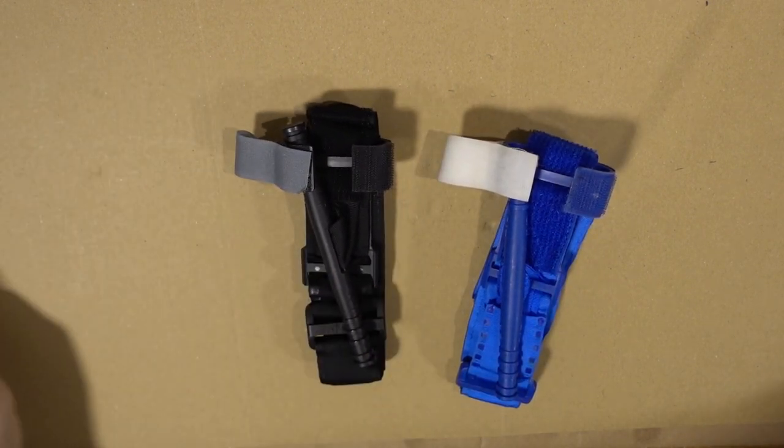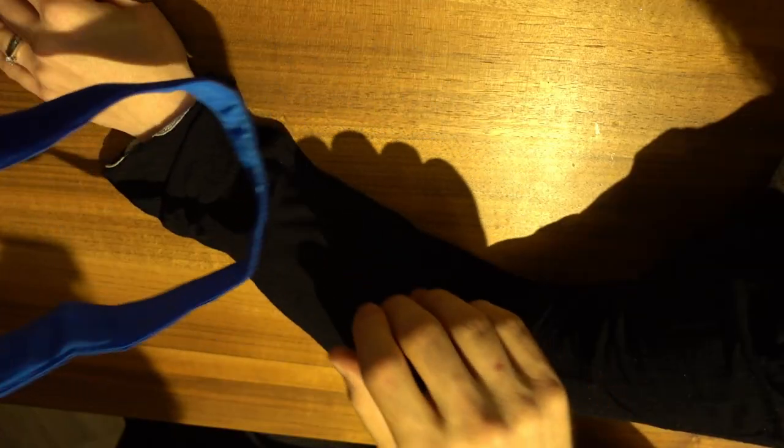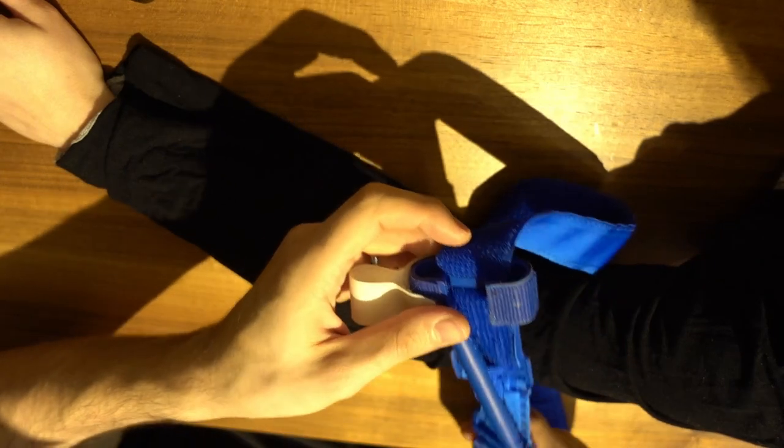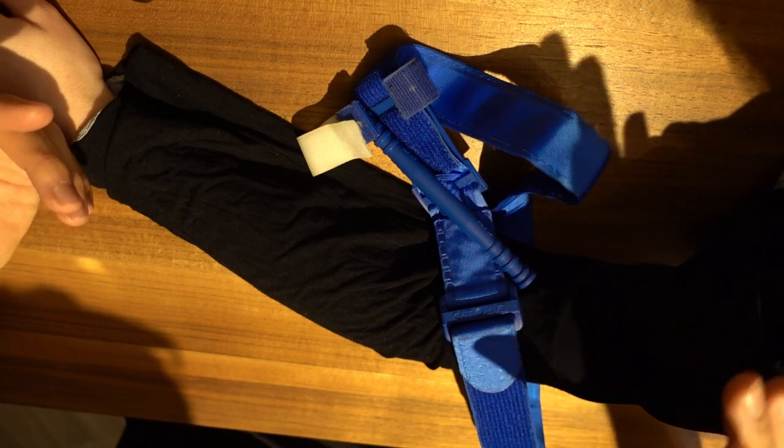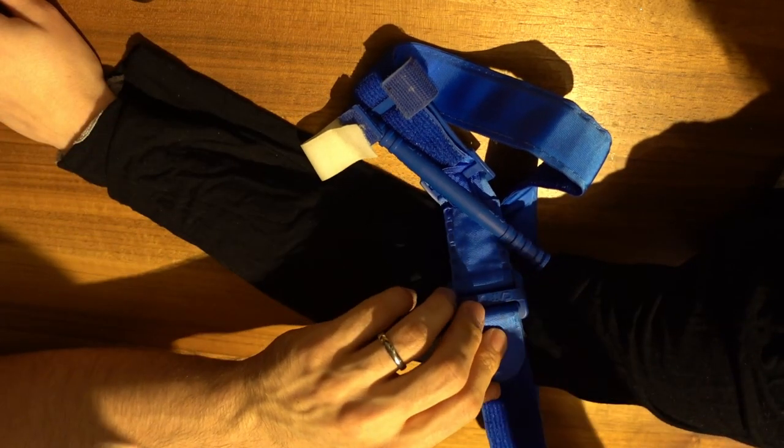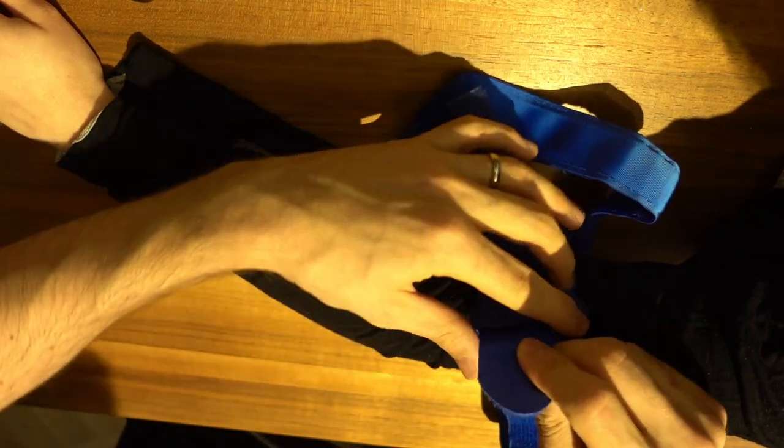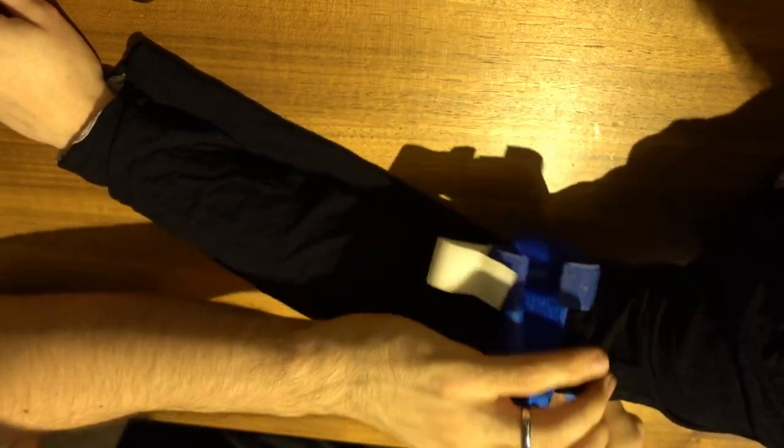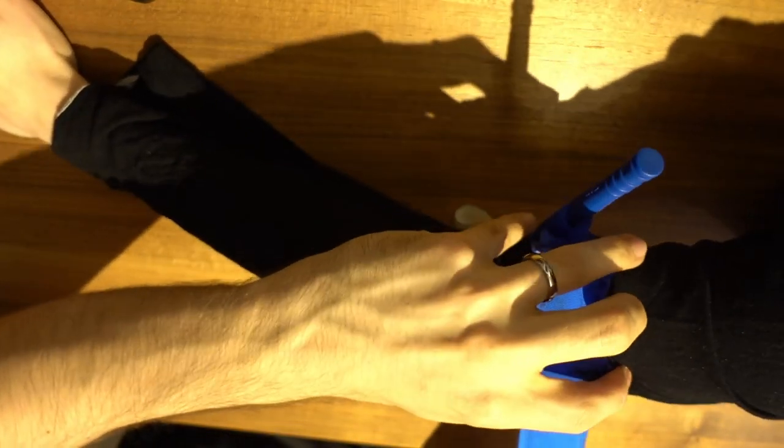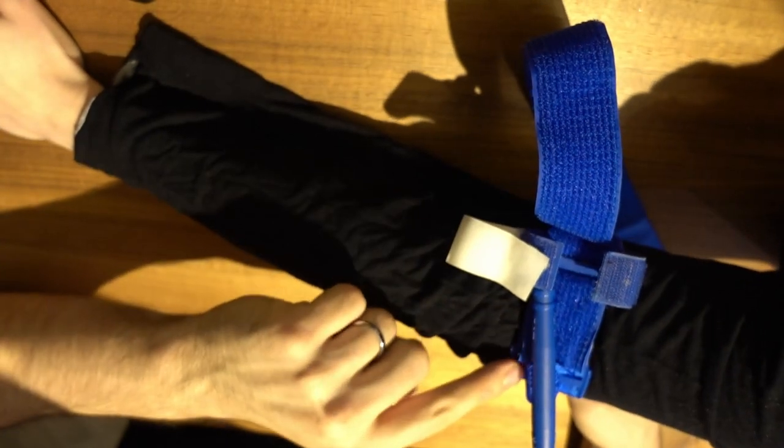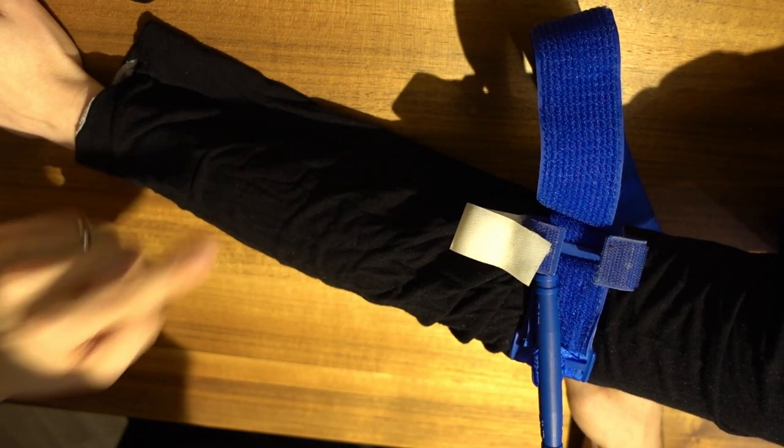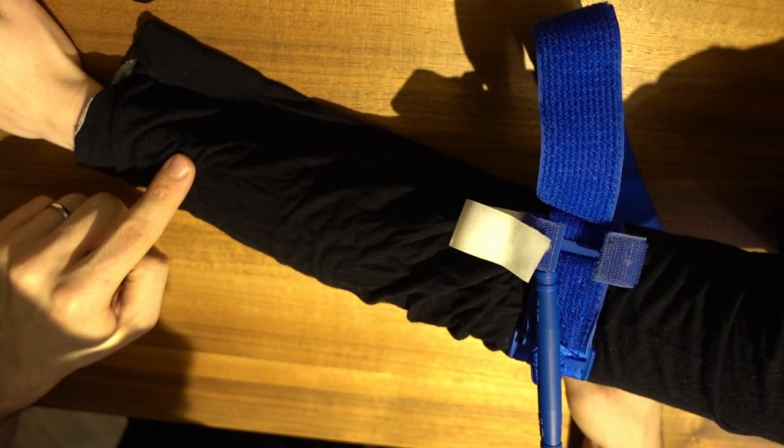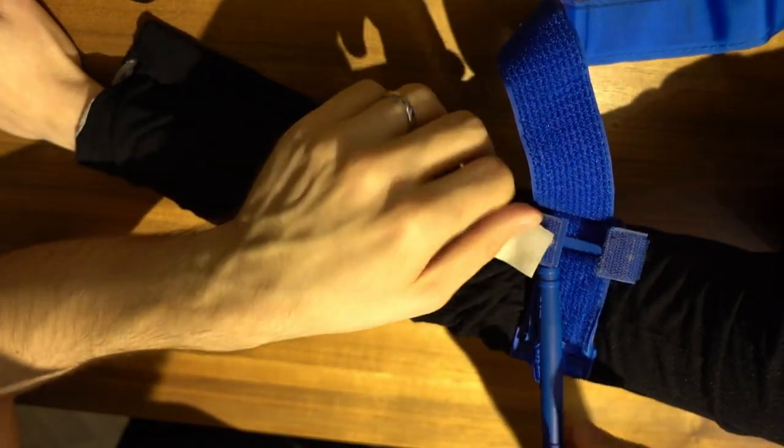So now I'm gonna show you how to apply the tourniquet. You're just gonna get it over the limb that is currently bleeding. Here just for demonstration purposes for the camera angle, I'm not gonna put it as high as I should so you can see it. But follow high and tight. The first thing is you're gonna pull on the velcro part and you need a really tight initial fit. You really have to pull and then start wrapping it. If you don't have this initial tight fit, you won't get the desired result. Initial fit very important.